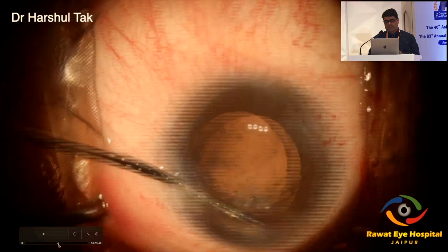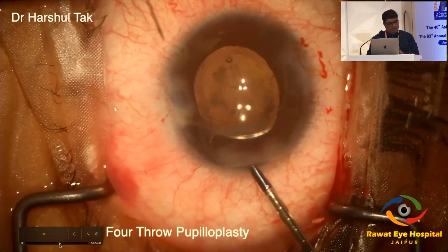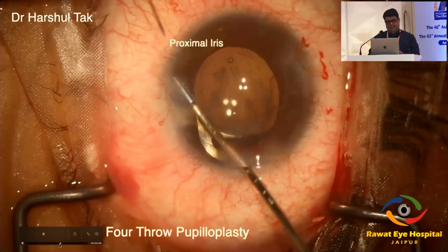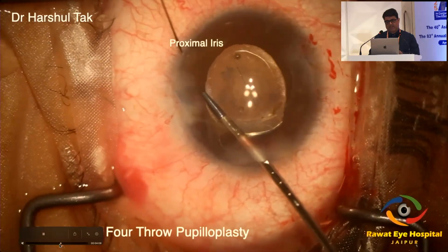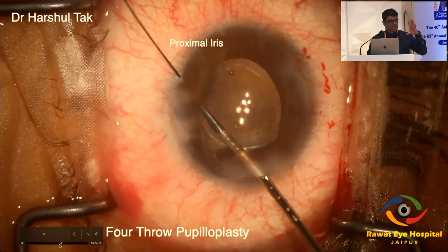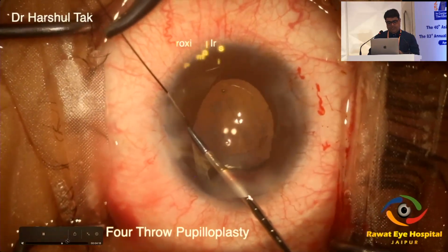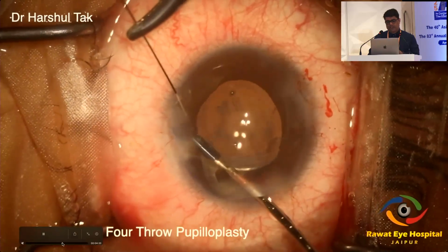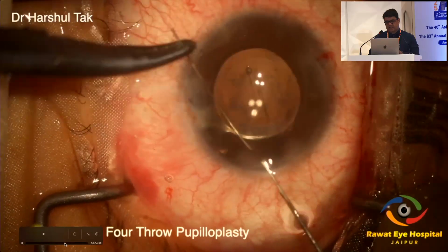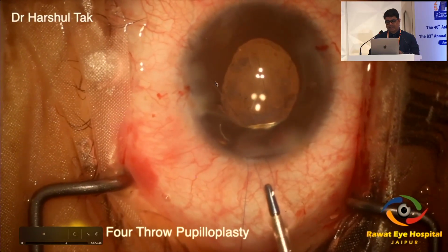then I try to constrict the pupil. This is a single pass 4-throw pupilloplasty, which is taught by Dr. Amar Agarwal, and it's very easy to use, and everyone should learn this. It's quite handy in many cases like traumatic mydriasis or even post angle closure glaucoma attack cases which have a fixed dilated pupil. You just go ahead and pass a 9-0 Prolene through one of the sides, and through the other side you pass this arm, and you take out this loop from this side of the iris.